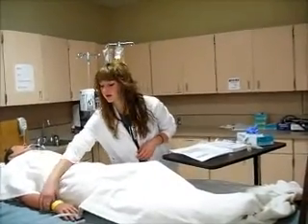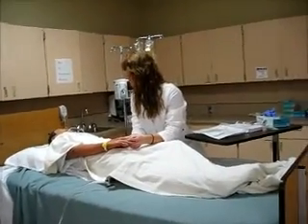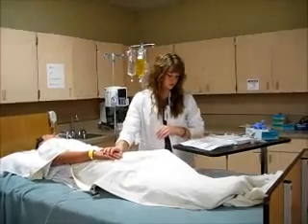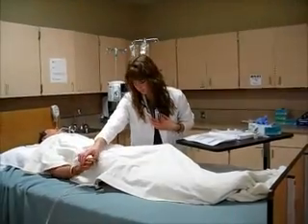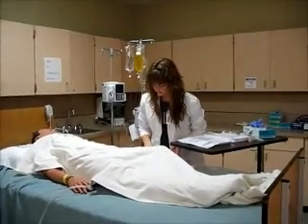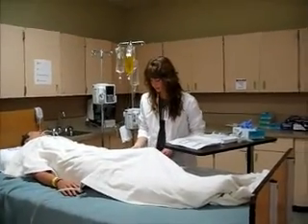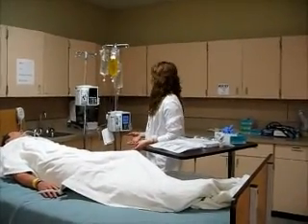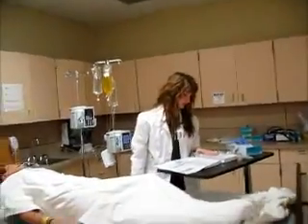I also want to do my checks, check his wristband. I'll have him say his name and birth date for me. I'm going to check for any allergies, and he does have an allergy to morphine, so he can confirm that for me, but that's irrelevant in this case. I can also check my IV site, make sure there's no infiltration, no extravasation, phlebitis or anything. And my IV that is running also looks good. He has normal saline running, which I have checked is compatible with the insulin I'm going to be giving.